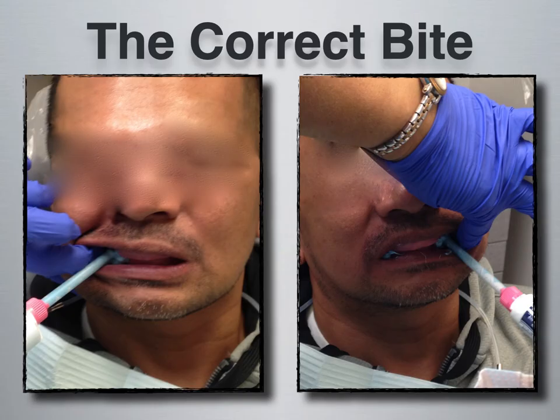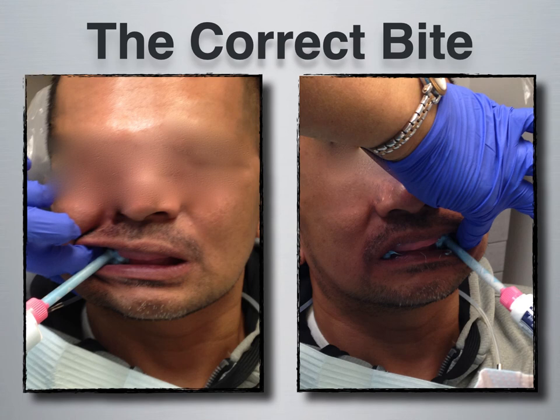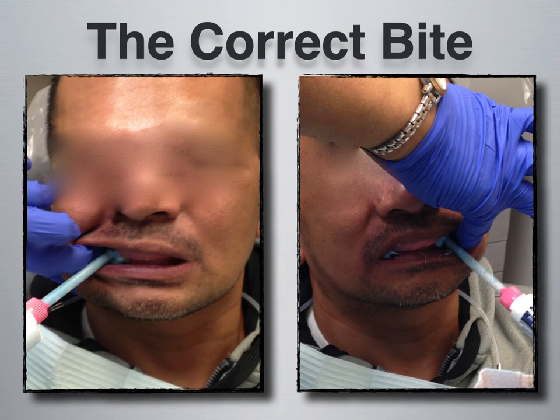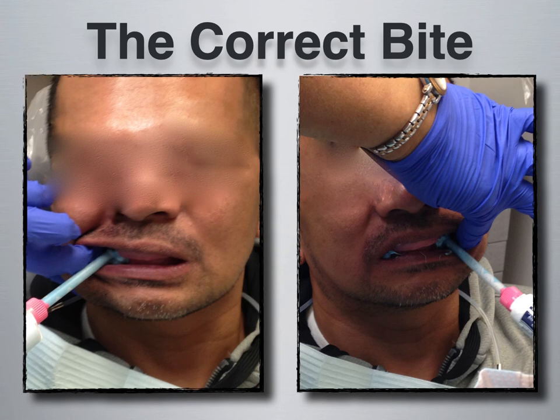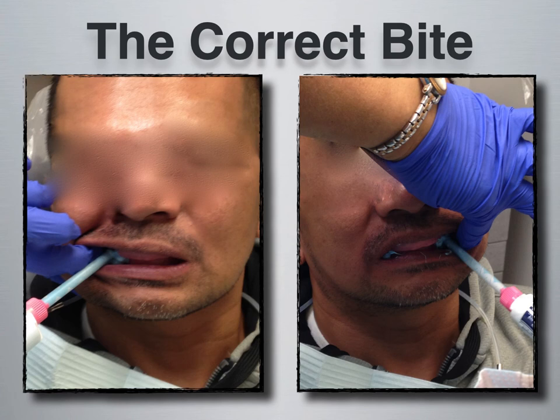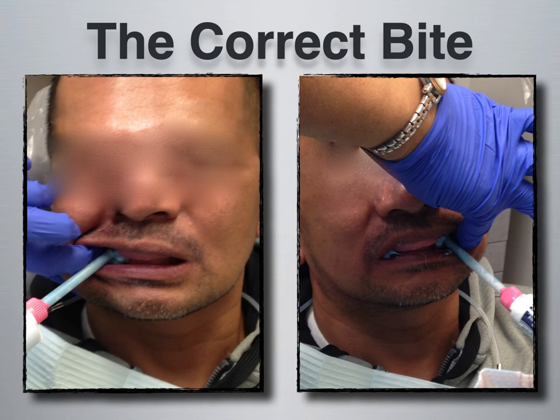These are all things that will lead to a successful case — all the generic things we've covered today about articulators. It's really the meat and potatoes of dentistry and articulators. There are so many different types of articulators and many companies that fabricate them, but the overall consensus is that articulation is a very important part of the restoration process, no matter the type of restoration or specialty.